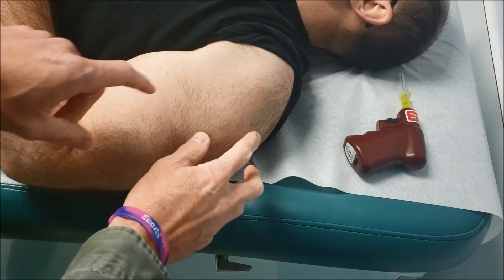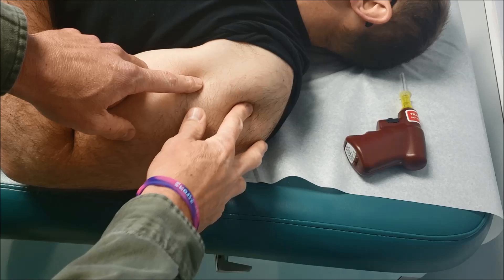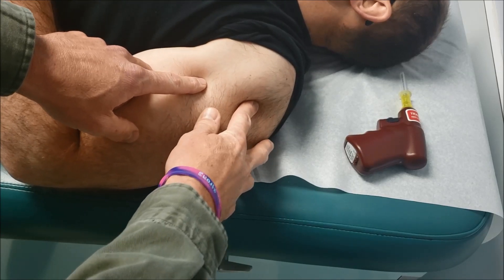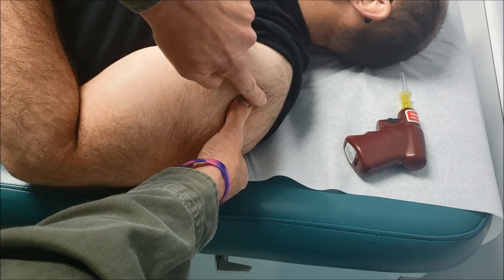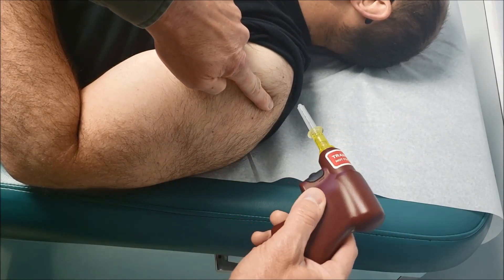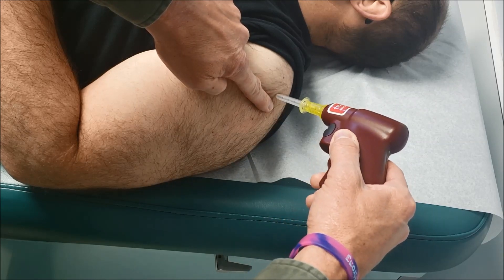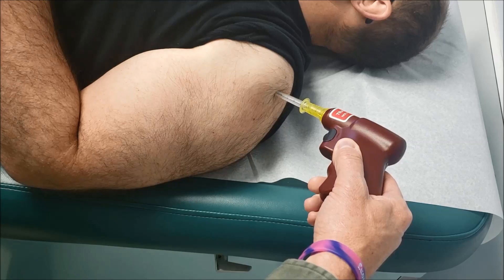When locating the proximal humerus site of insertion, remember you're looking for the greater tubercle, the surgical neck of that bone, which you can feel as it comes up the shoulder. You want to go approximately two centimeters above it. Your insertion of your needle is at a 45 degree angle. Remember that the reference point is you're going to aim at the opposite hip.